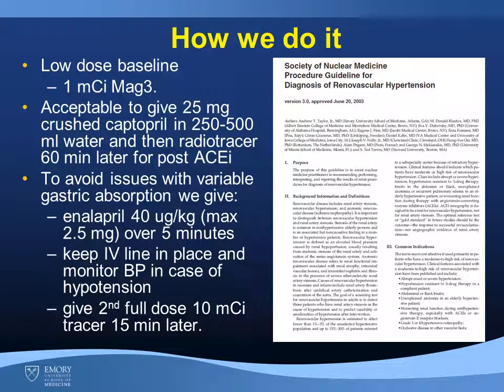What we do at Emory is get a low-dose baseline first with 1 millicurie of MAG3. Now I have to mention that it is acceptable to give 25 milligrams of crushed captopril in water and then repeat the study 60 minutes post ingestion of the captopril.